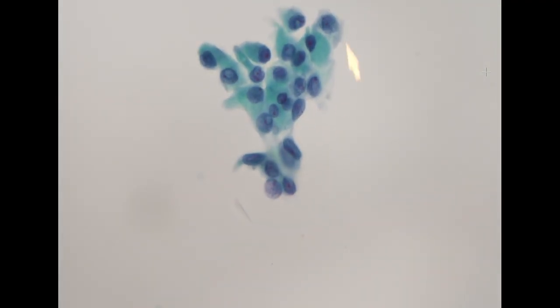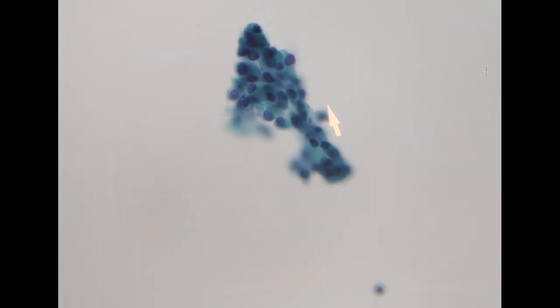So this is papillary thyroid carcinoma, and the atypical cells are throughout the entire specimen, so we will be really confident to just call this TBS 6. So that's all the cases for today.